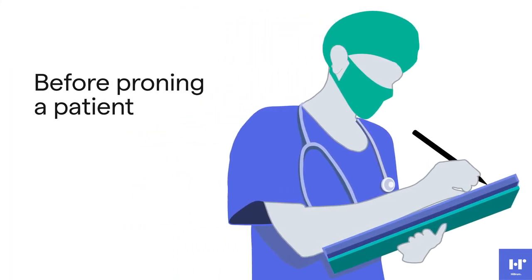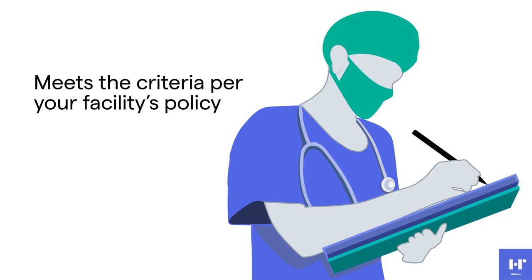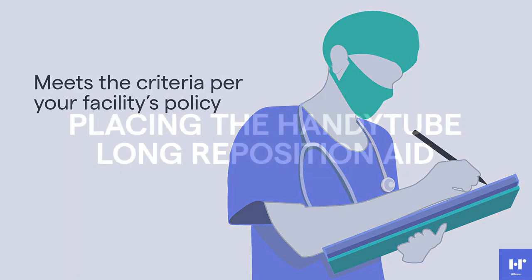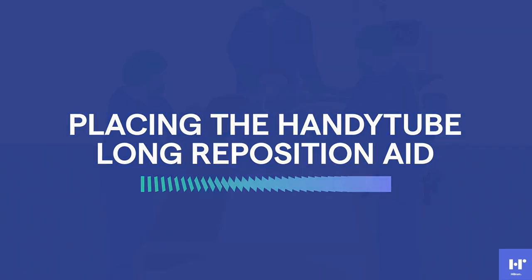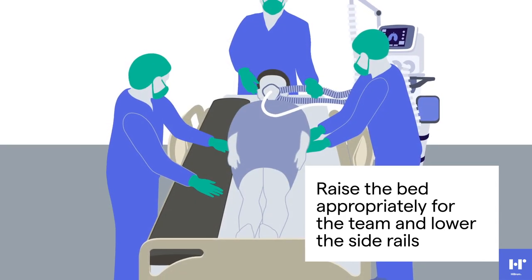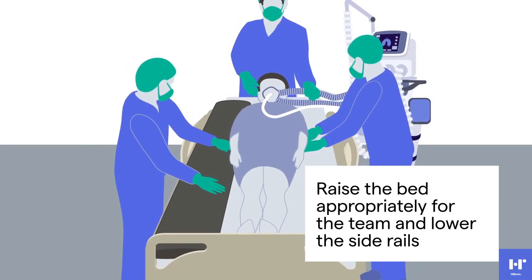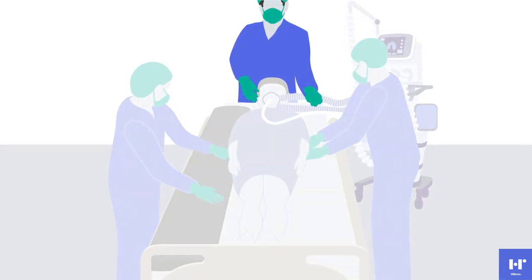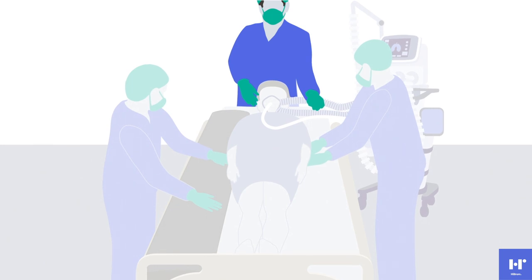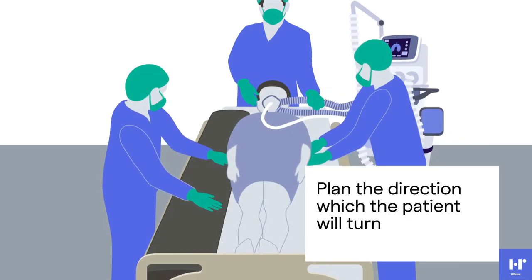Before proning a patient, make sure the patient meets the inclusion criteria per your facility's policy for the procedure. Raise the bed to a good working height for the care team and lower the side rails. The care team member at the head of the bed will manage the airway and monitor the entire procedure. Plan which direction the patient will turn.